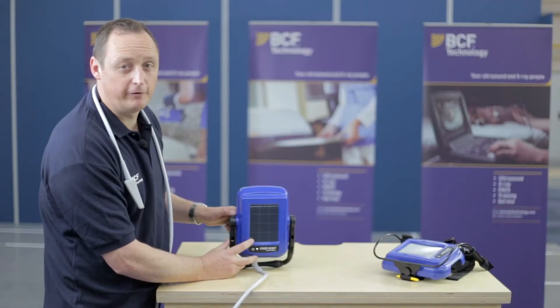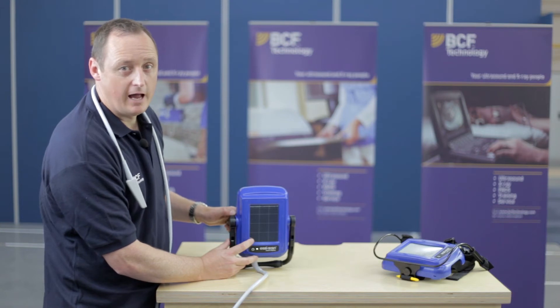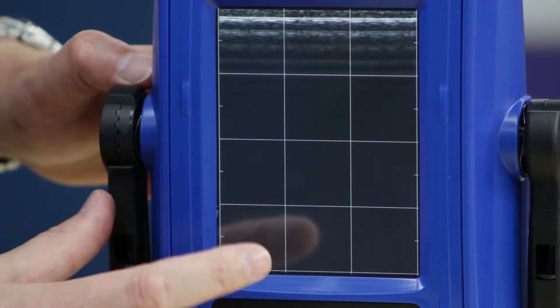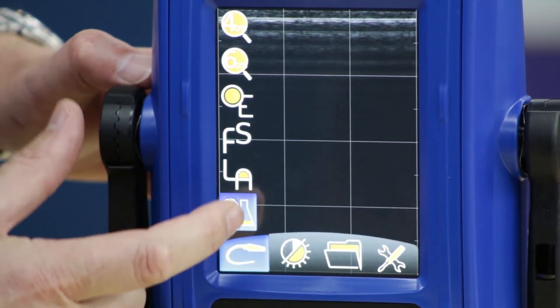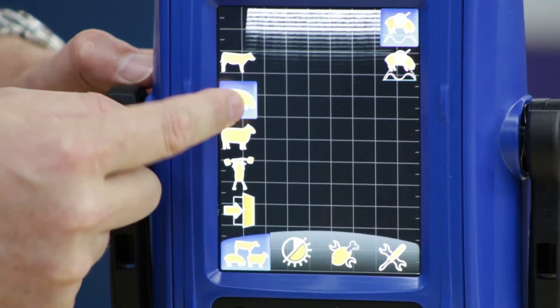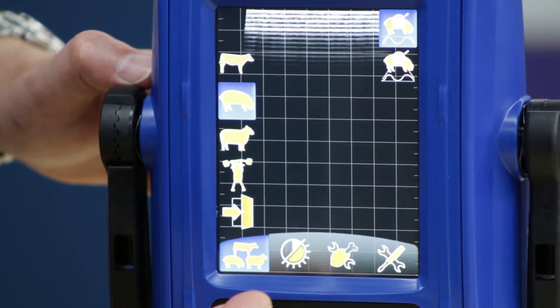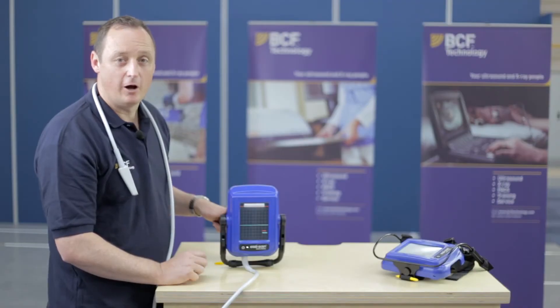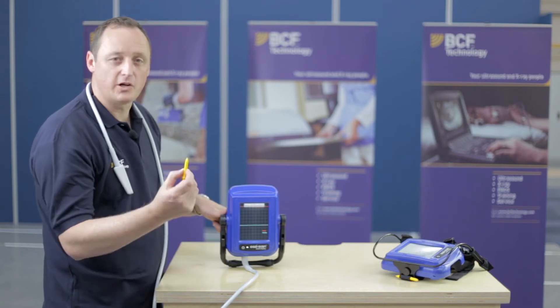If it's back fat that you're looking for — to take measurements for pigs or sheep — we can go into the menu, press the back fat option, and select our species in terms of cow or, in this case, pig. The screen would then disappear and we're now ready to scan the pig.